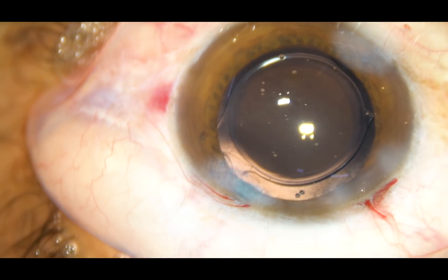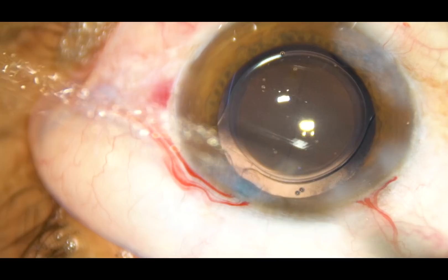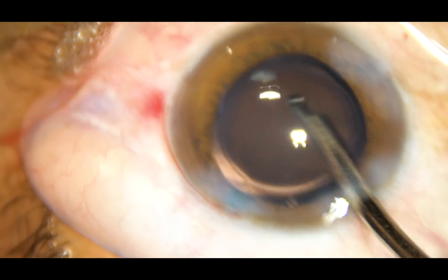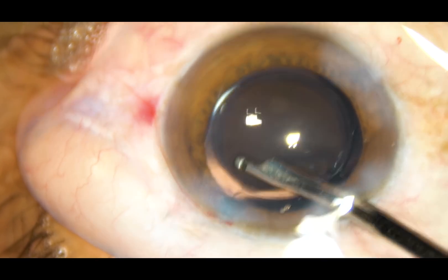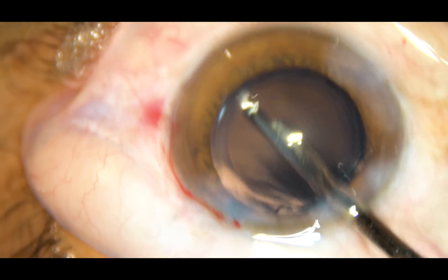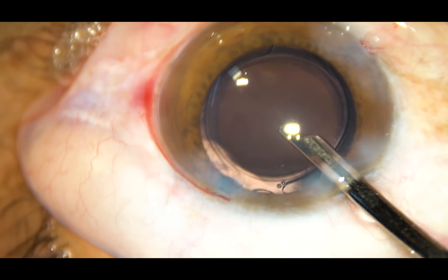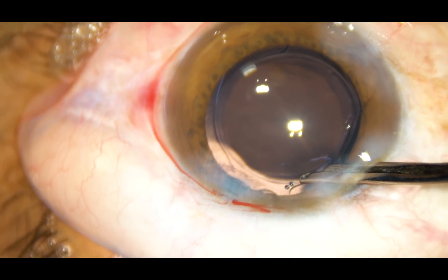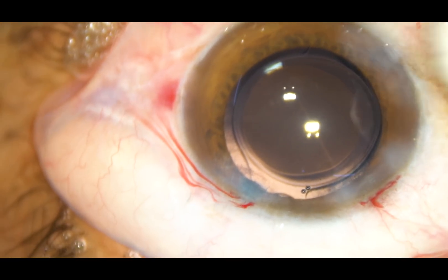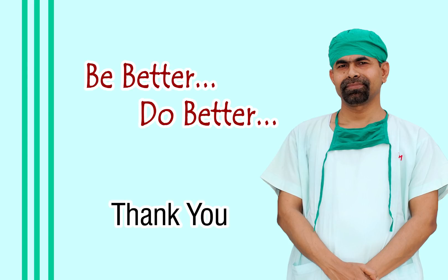Now the side ports are hydrated to close these wounds. My experience is that smaller side ports need more hydration than larger side ports. The smaller side ports are stressed and there is some amount of fishmouthing, so we have to hydrate these side ports a lot. If the side port is a little larger, less hydration is required. After a thorough lavage of the anterior chamber, the side ports are checked and the case is concluded. Thank you very much for watching.